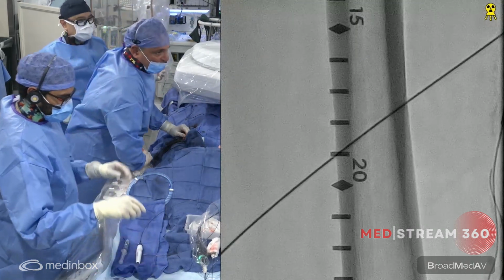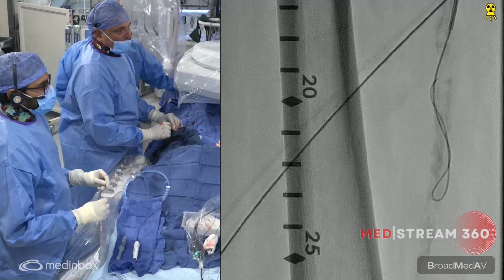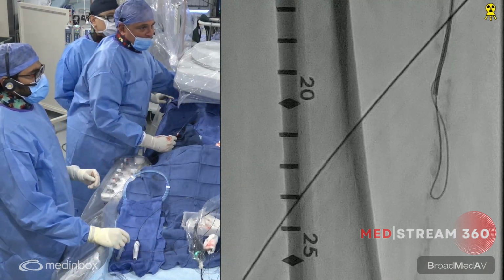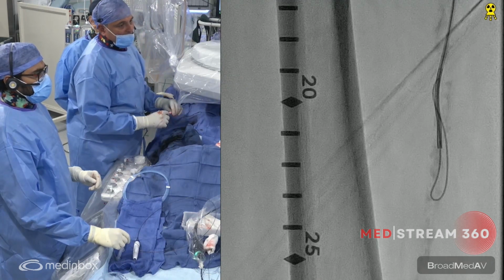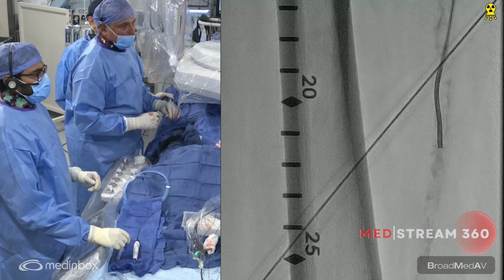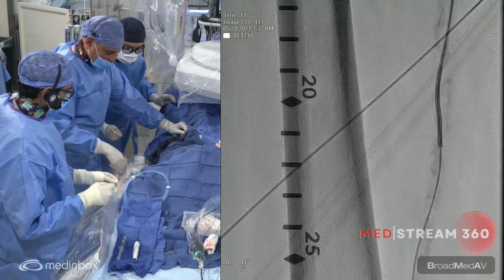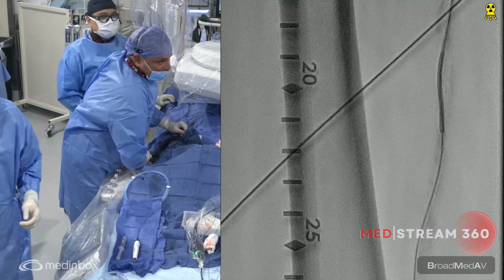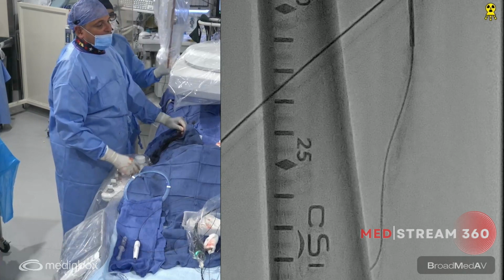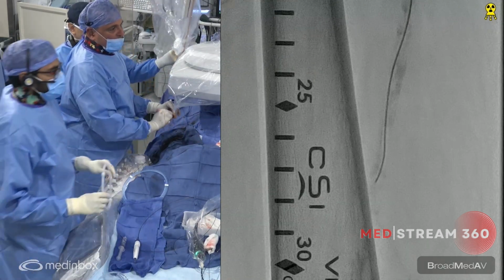So now we've crossed the lesion, I hope. You know, although I shouldn't be that confident, maybe I'm not. So let's see here. It felt like it popped in, but I could be wrong. So I'm just going to leave it at this level and see whether I can just direct my wire. Nope, I'm not in the vessel, that's for sure. Yes, I am. There I am. So we're in the vessel. You know, anyhow, we managed to get into the vessel, hook or crook, as my dad used to say, and so now we're in the vessel. So now we're just going to go ahead, advance the wire. That's a good sign. That means we're in the collateral.